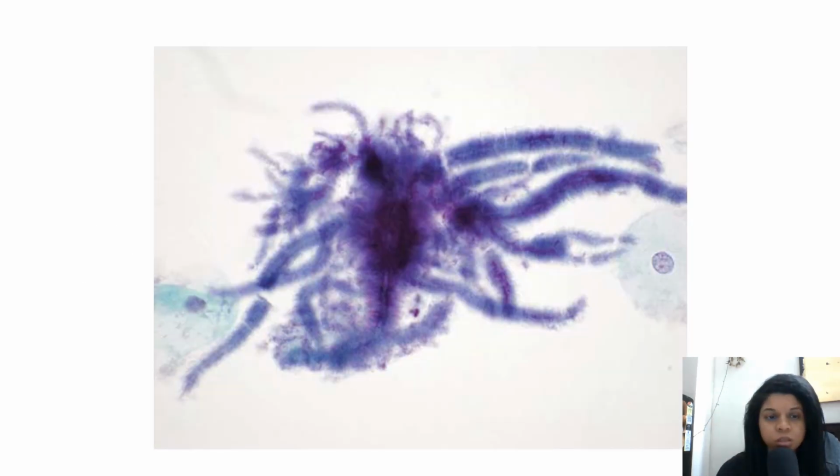First, when I saw this photo, I was a little bit taken aback because it looks like a tarantula spider. If you have seen the spider in Google Images, you can see. I have not seen the spider actually. Also, I'm a little bit arachnophobic. Anyway, so what are these organisms? These filamentous, woolly structures arising from it. It's not a big spider or something.